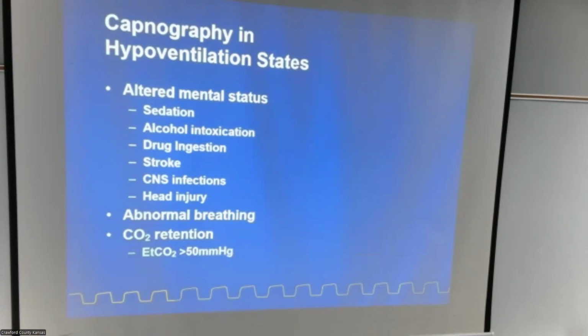Hypoventilation states: altered mental status secondary to sedation, alcohol, drug ingestion, stroke, CNS infections, head injury, abnormal breathing, CO2 retention, or end tidal CO2 of 50. Don't you love how head injuries are on both sides of the spectrum there? You might tell me why. Why can head injury be low and high? It depends on how bad the injury is.